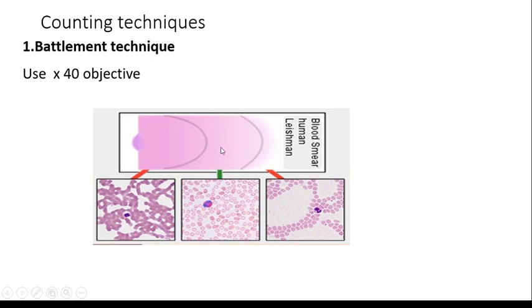This is the body. This is the feathered edge. The feathered edge is going to be a little bit too thin. Between those two areas, we find white blood cell differential and red blood cell morphology.